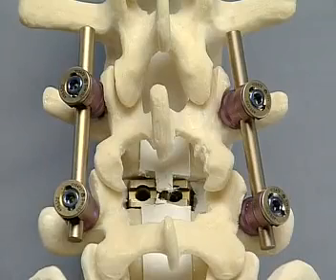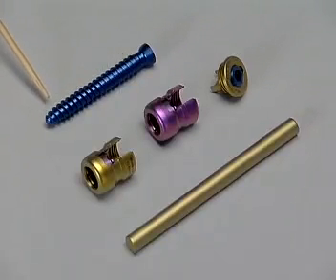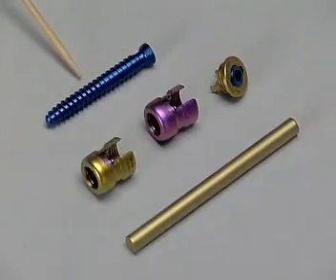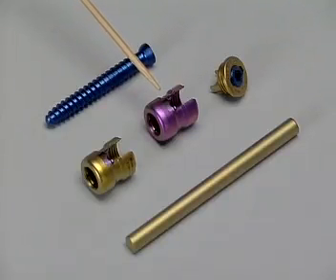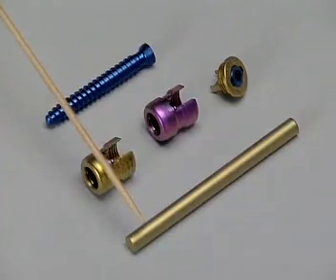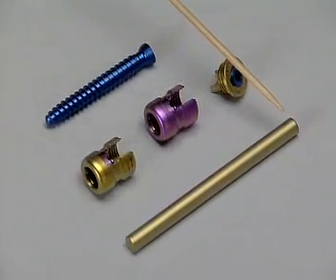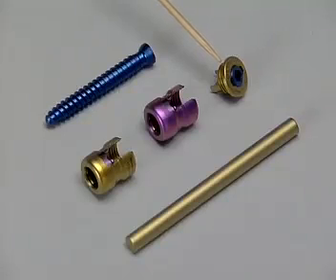In this exercise, the Cliquex system will be used. The implants needed are Cliquex pedicle screws with a dual-core and double-thread, and Cliquex 3D heads. For demonstration purposes, they're colored purple and can be removed. However, for use in patients, they are gold-colored and, once applied, cannot be removed. Also required are Cliquex 6mm rods and Cliquex locking caps with an inner 3.5mm hexagonal screw.